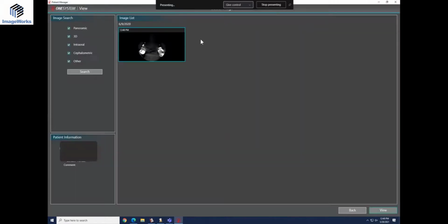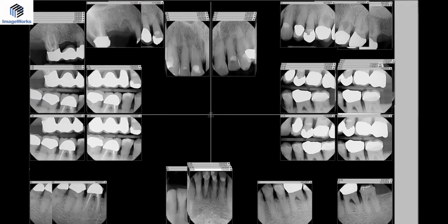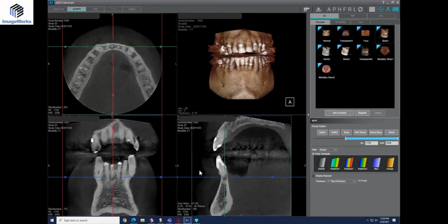Let's see if I can close this all out. Okay, I just wanted a better picture of this tooth, and to make sure nothing else was going on. So we did the cone beam. Fortunately, I looked at the cone beam because, as I recall, he was asymptomatic with everything. So let's close this down. And there's his infection here on that tooth.